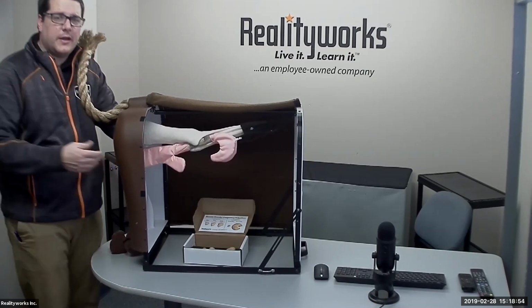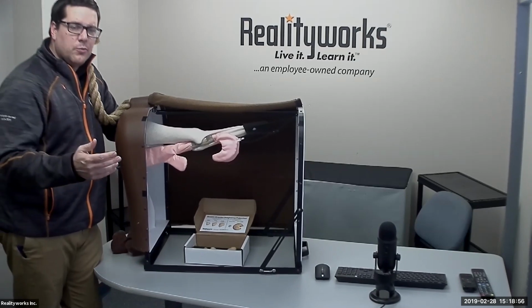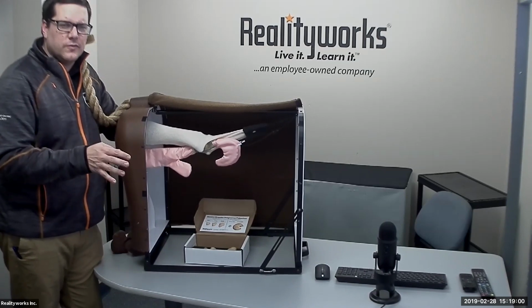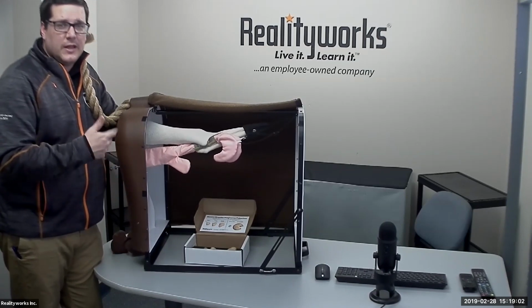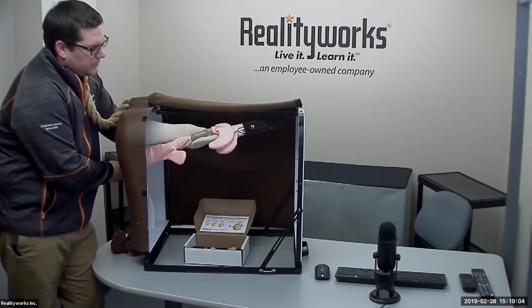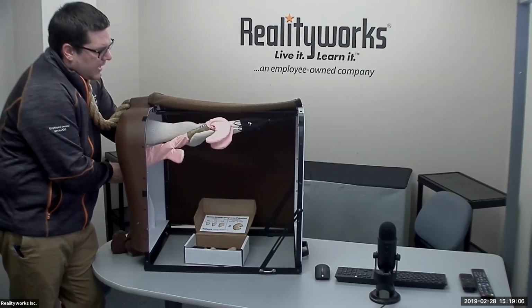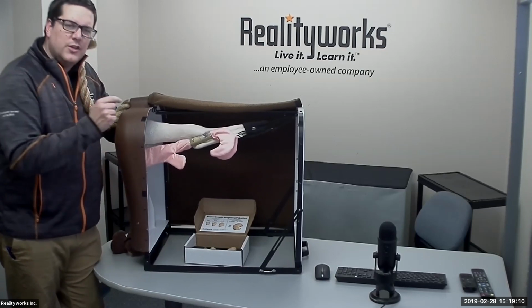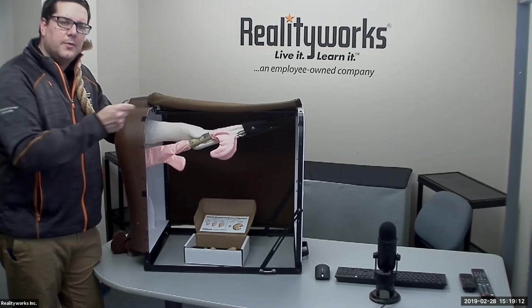The problem that a lot of students will have is that they will try to jam it in. That can be very dangerous because it can hurt the cervix of the animal. It could ruin it, so that they wouldn't be able to be bred anymore. The other side that you have to be careful of is, as you push through, you may get into a fold, and so you have to back up and then move forward.